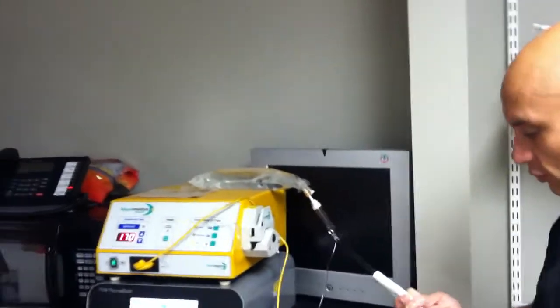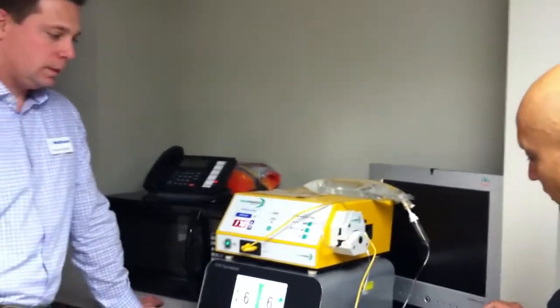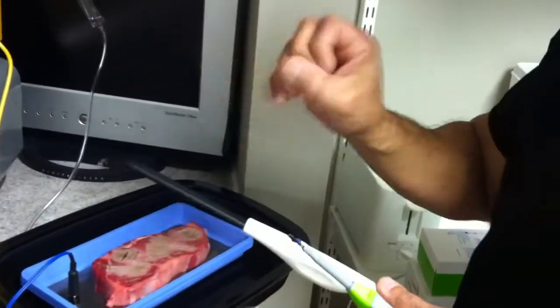Okay, so there's saline that goes through here? Okay, got it. I didn't really get that far. So it actually pushes saline. Where does the saline come out of the tip? Just those two things? Yep. So it just squirts water.